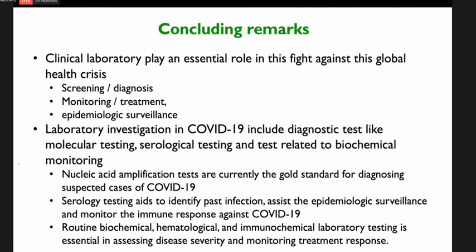Laboratory investigation in COVID-19 includes diagnostic tests like molecular testing, which is the gold standard for diagnosis, serological testing that can be used to identify past infection or assist epidemiological studies, and monitoring of the immune response. It also includes tests related to biochemical monitoring, for example routine biochemical and hematological investigations that give very valuable information to assess disease severity and monitor the treatment process.